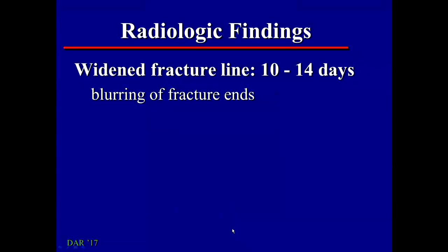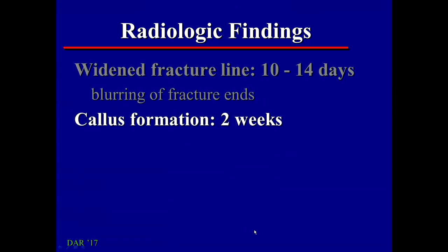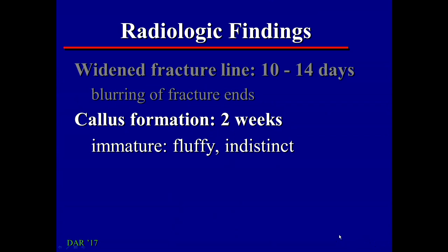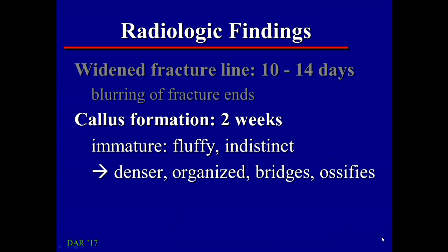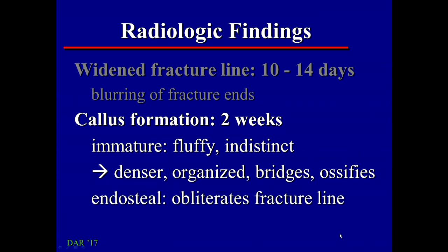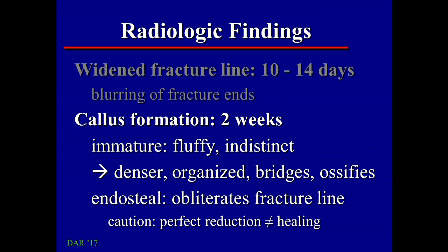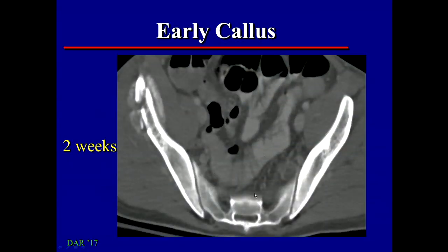The second major finding of healing is callus formation. The earliest callus formation is recognized at around two weeks. It initially is immature bone, and that looks fluffy and very indistinct. Over time, that will become denser, more organized, and will eventually bridge the fracture and then ossify. The callus on the inside of the fracture we recognize as obliterating the fracture line. In a case where operative reduction has been done with a perfect reduction, the fracture line disappearing doesn't necessarily mean it's healed — we have to see bone going from point A to point B. On CT at two weeks, you'll see very indistinct, cotton candy-looking new bone formation.